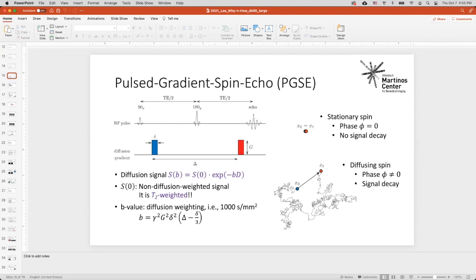In general, it could apply to body imaging for denoising, Gibbs ringing removal, and spatial noise correction. But FSL topup and eddy, in other words, distortion correction due to field inhomogeneity and eddy current and motion, are specifically designed for brain images.